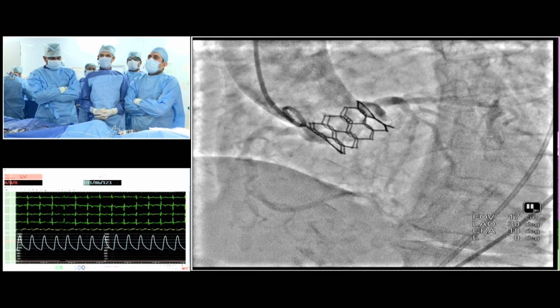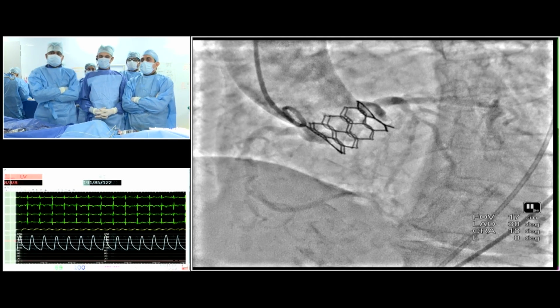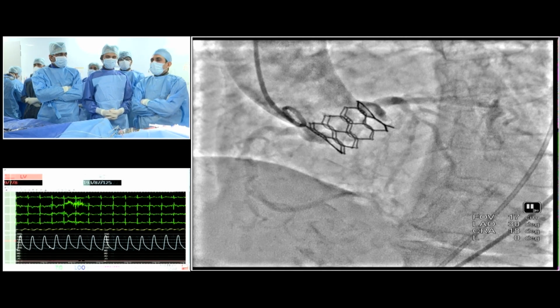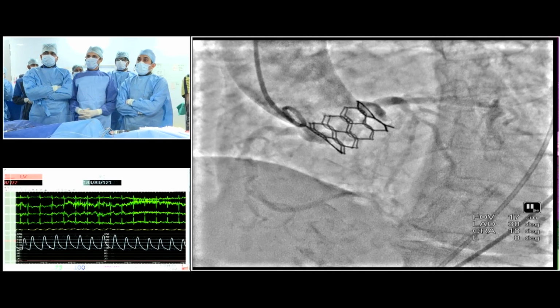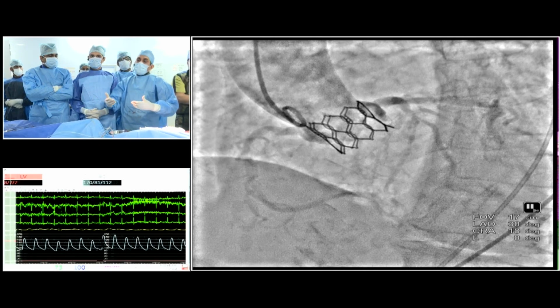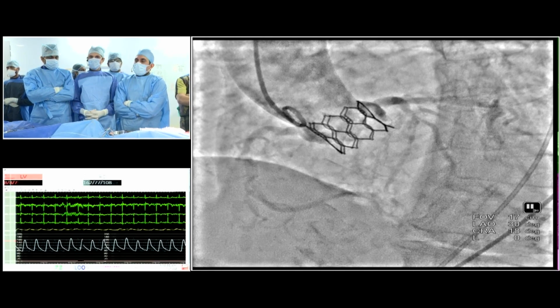Have I used a lot of octa-cores in heavily calcified valves? Not yet. We are just gaining our experience. But in all the valves we have done, regarding the radial strength and the expansion, it is almost similar. The only advantage is the deployment is more predictable compared to the first generation valve. As you saw in this case, you have to train your eyes: when you start deployment, you feel it is very shallow and might just pop out, but it just remains where it is. So to answer your question, I haven't seen any difference, but we have to wait for more and more cases.